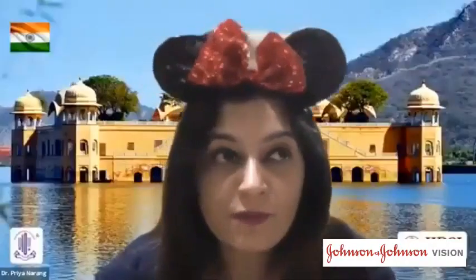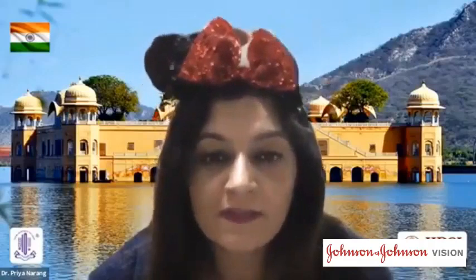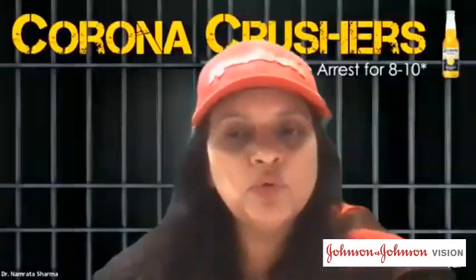Yeah, that's a very good question from Dr. Harsh. I think he's a glaucoma specialist. The progression data analysis, yes, we are all working on it in our team, and it should be there in the device within the next 3 to 4 months, because it's a new device that we have launched. Progression data is something that comes up over a period of time, and we are definitely going to incorporate it into the device. Maybe just give us 3 or 4 months extra. Yes.